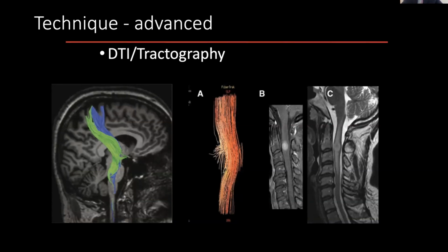There are different types of diffusion imaging. More broadly speaking, diffusion imaging is any kind of imaging that will show you the passage or osmosis of water particles, and more importantly, where is that motion of water molecules restricted? A condition we call restricted diffusion.